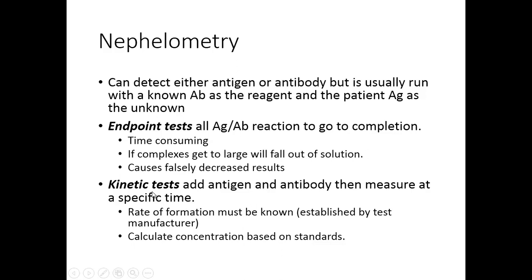Kinetic tests, on the other hand: you add the antigen and the antibody, and instead of letting the complex formation go till completion, the manufacturer sets a time to stop the test.